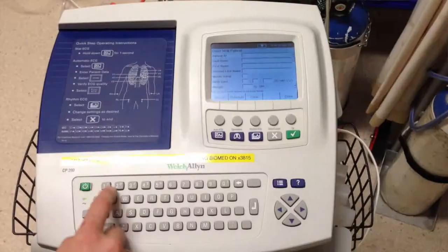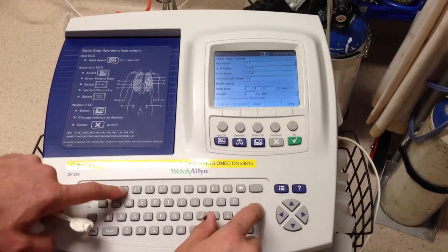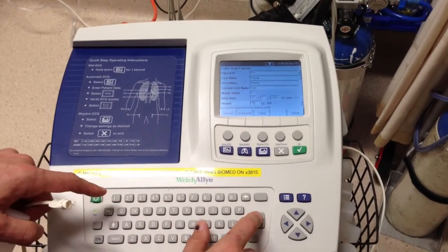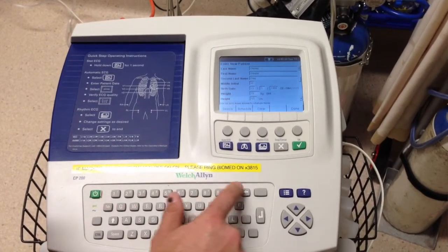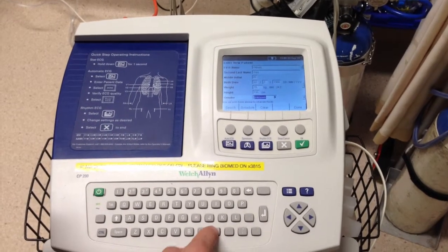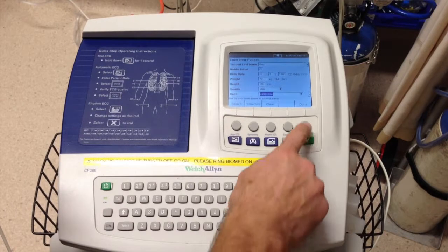Then it asks you to put in patient details, so I'll just enter some details quite quickly because it doesn't like to miss anything out. It asks for the patient's date of birth. Things to put in are the patient's weight and height — they make it more accurate if you can get those details. Put in gender and race, because different races have different norms. We put in Caucasian and then press done.